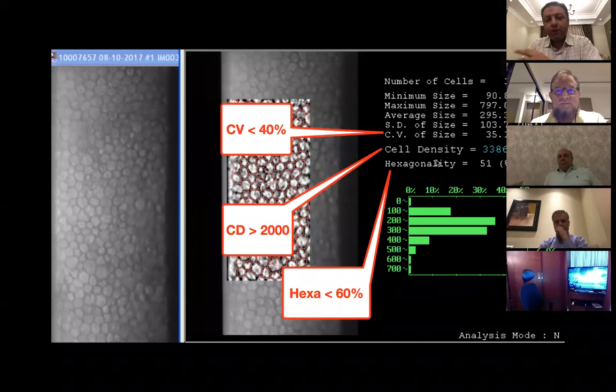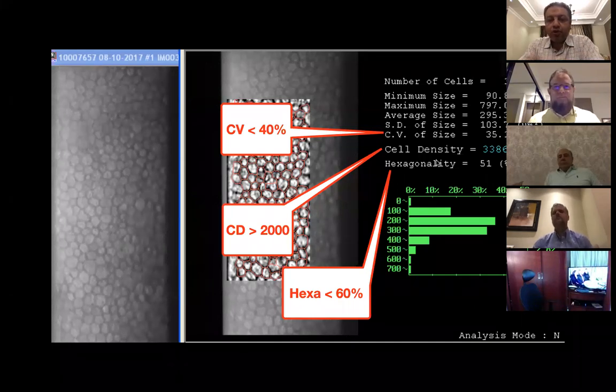So I was following this patient every 6 months with specular microscopy. And when I found that there was a downward progression or loss of the endothelial count, and the hexagonality was also changing, I took the decision to remove just one eye. The second eye was well, so I didn't do it. Okay. Great.